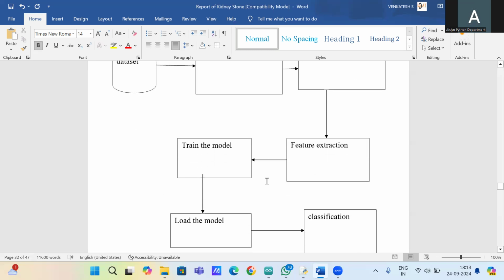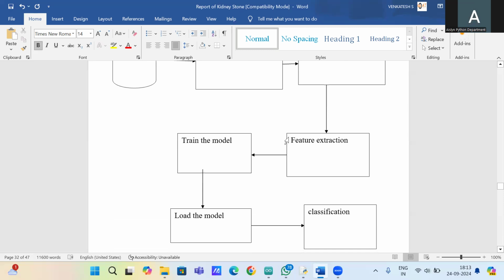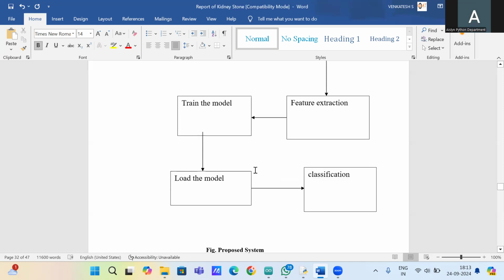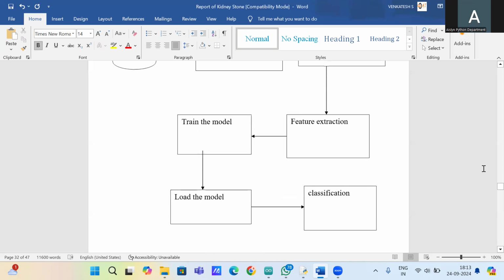I will explain it in the training code. And this is the train. After this feature extraction, the features will be trained by the model. After that, you will save the model and take that model to your testing code. With the testing code, you classify the image. So this is what is happening in your project. Now I'll show you the training code.